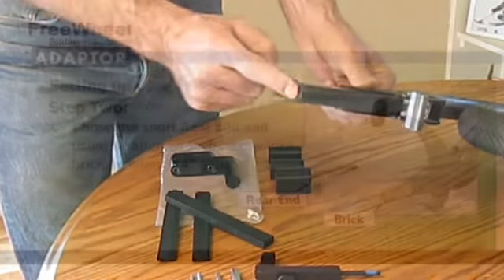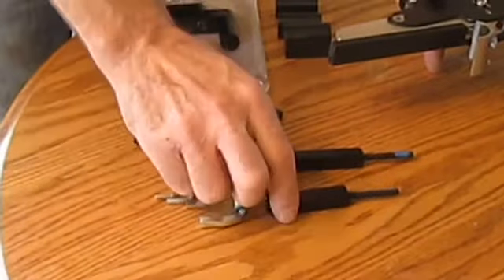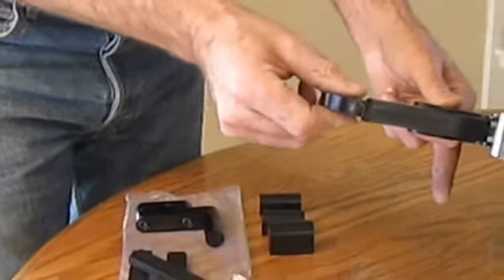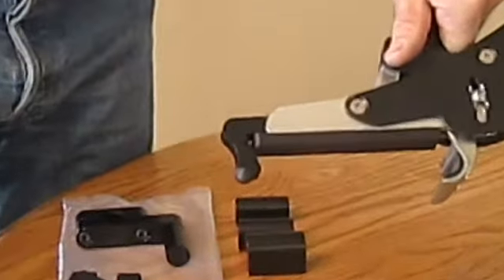Step two in setting up the FreeWheel is to take the shortest rear end and, using an Allen wrench, screw the rear end into the brick. Do not tighten all the way — leave about a quarter inch gap between the rear end and the black shim. You will finish tightening it once it is attached to the adapter hitch.